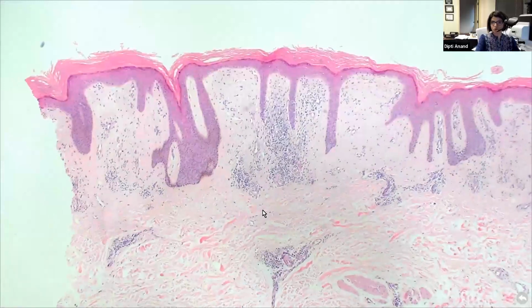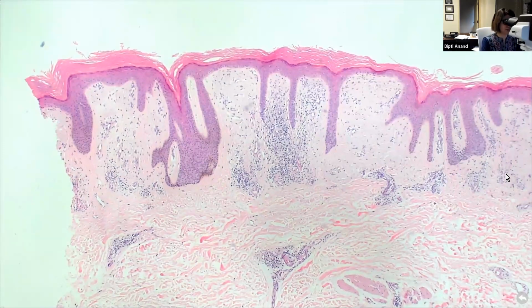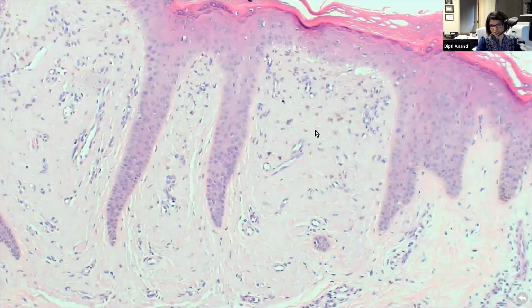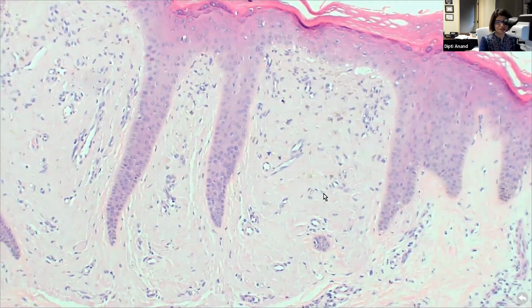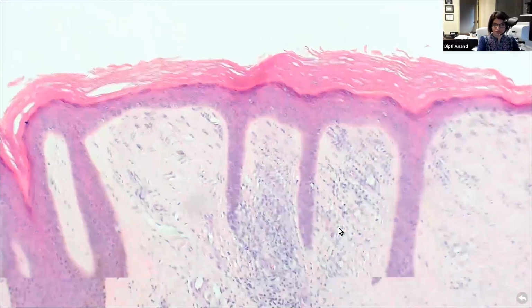So that's macular amyloid. Lichen amyloidosis, which most commonly presents with lichenified papules on the lower extremity, can clinically mimic lichen planus. It presents with more obvious changes. The overlying epidermis often shows epidermal hyperplasia with acanthosis and hyperkeratosis, as you can see. You can see patchy lichenoid inflammation, but again, your papillary dermis is going to be filled and expanded by this amorphous pink material. So this is more obvious than macular amyloid because you have a clearly thick epidermis which shows features of LSC along with inflammation. And again, this stains more prominently with crystal violet as compared to Congo red. So that's your lichen amyloid.